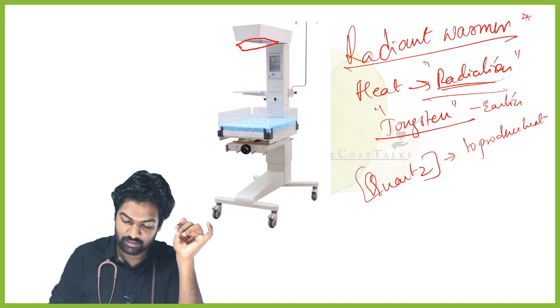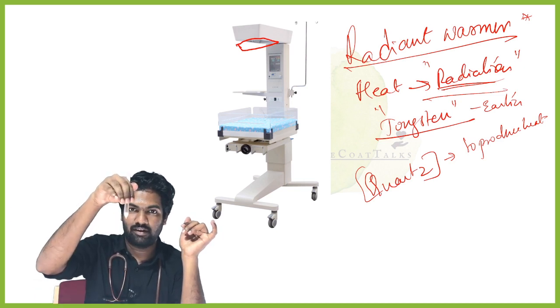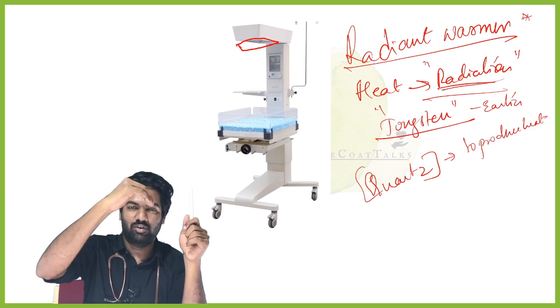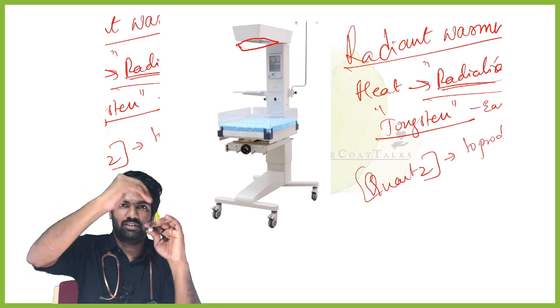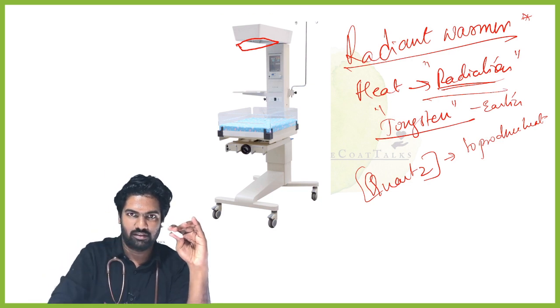That much area will have this tungsten filament like this, and above that there will be some curvature like this. These are called parabolic reflectors. This is the tungsten filament, and this is the parabolic reflector. Because it is shaped this way, almost all the heat is directed under this only.